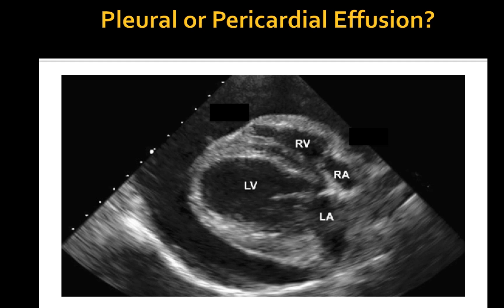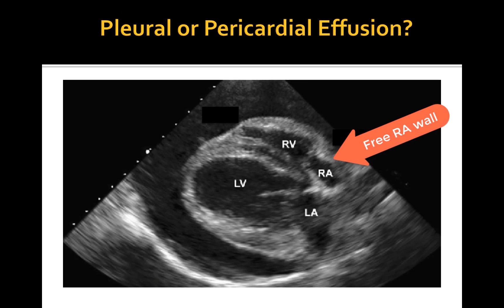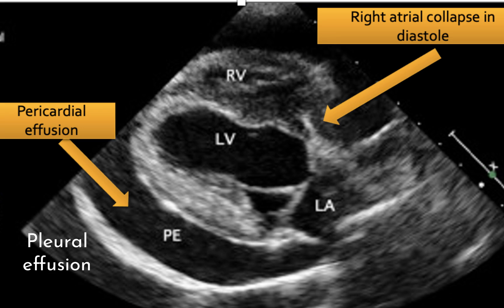This is a right parasternal long axis view of the heart. There is a moderate to large amount of pericardial effusion surrounded by a hyperechoic bright structure representing the pericardial sac. The free right atrial wall is partially collapsed, suggestive of true cardiac tamponade. In a very similar image, you may appreciate a complete collapse of the atrial wall and partial collapse of the free right ventricular wall, consistent with severe cardiac tamponade.